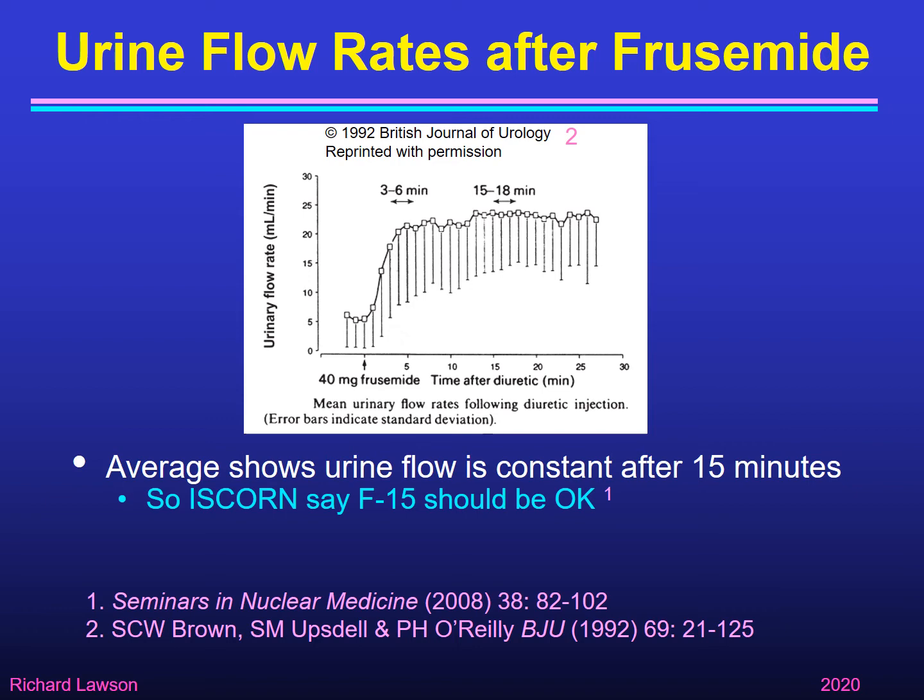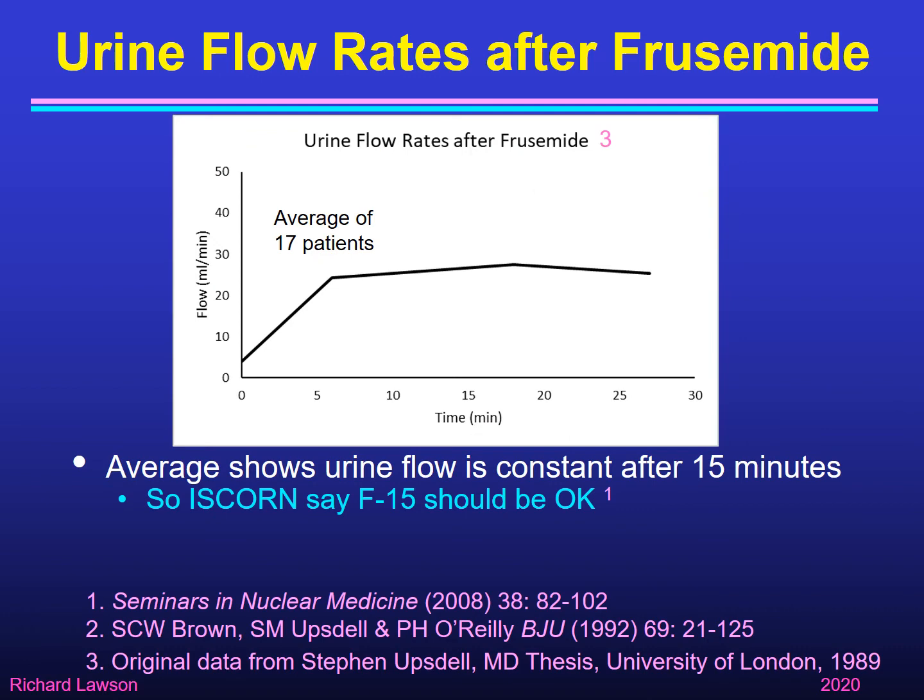And I know that work was started by Steve Upstill when he was working in our department, so I've gone back to his MD thesis, which was published in 1989, and looked at the data there. He has data there from 17 patients, which was a subset of those from the BJU article, but it shows the same effect. The flow rate increases and then is fairly constant at about 25 mils a minute after that.